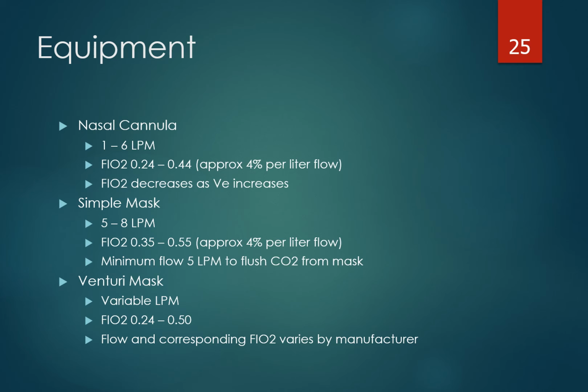FiO2 decreases as minute ventilation increases. So what happens is, as you breathe quicker, you entrain more air, and that's why there's a decrease in FiO2.